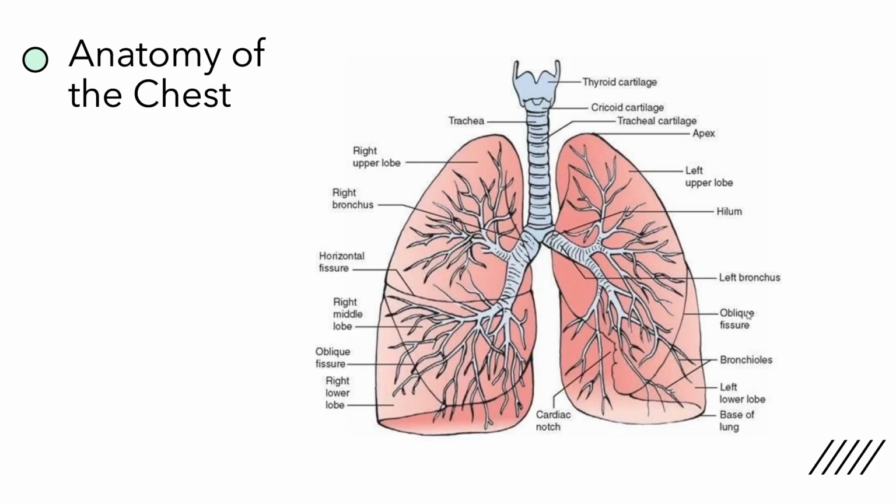Generally, when we talk about the lungs, what we want to capture on imaging, and what is sometimes cut off in poor imaging, are the apices or the apex of the lungs. Apex is singular, apices is plural. The apices are where sometimes we have tumors within the lungs that like to try to hide, especially since this is an area with a lot of overlapping bone from those ribs. So it's really important that we're able to visualize those appropriately.